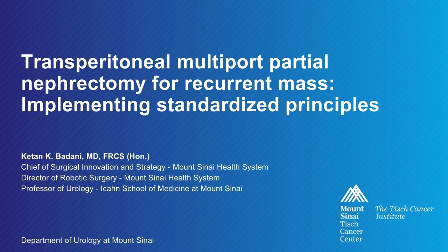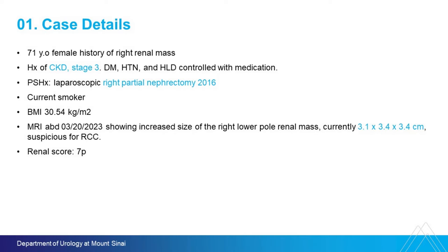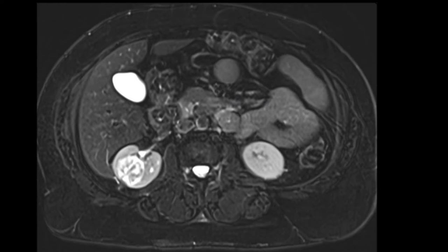Let's go to the case. I was asked to show a transperitoneal approach, multiport partial nephrectomy. This is a recurrent renal mass on the right side. I'm going to show how we implement our standardized procedures. So, a 71-year-old female had a history of a partial nephrectomy on the right side in 2016, a little bit on the large side, BMI of 30. Here you can see the completely endophytic lesion — recurrent tumor on the same side highlighted here.